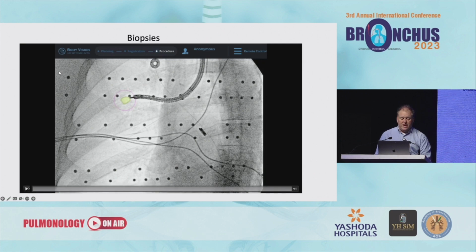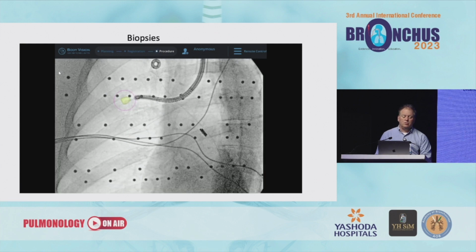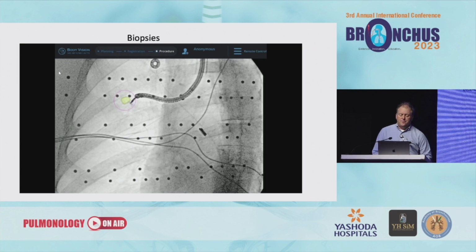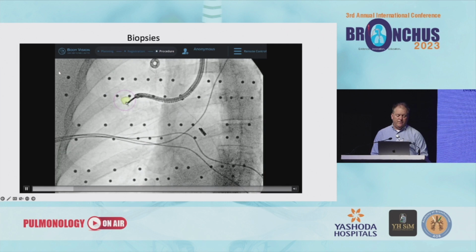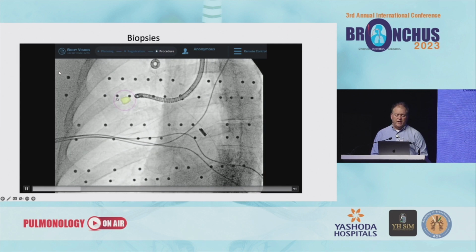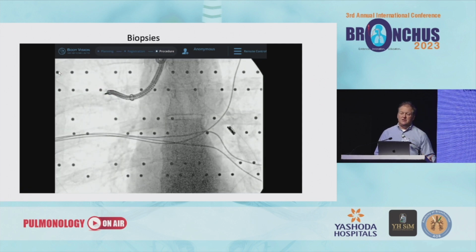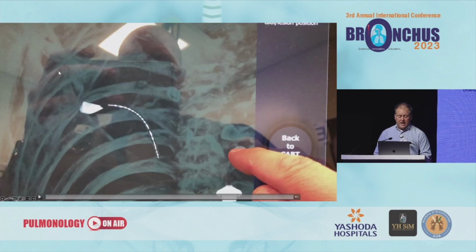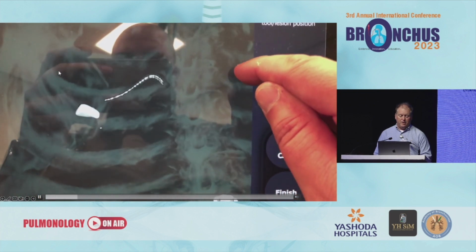And what that allows you to do then is, while you're taking your biopsies, know that that little circle is exactly the lesion you want to biopsy, no matter what the virtual representation was telling you. And the thing that's interesting is how much this yellow ball moves when you turn on the updated lesion. It was originally over here and then it slides over. And especially with a small lesion like this, that is the difference between a successful case and an unsuccessful case. This ended up being metastatic head and neck cancer. And again, you get these three-dimensional views that are really cool looking. This is as we were putting a catheter near it.